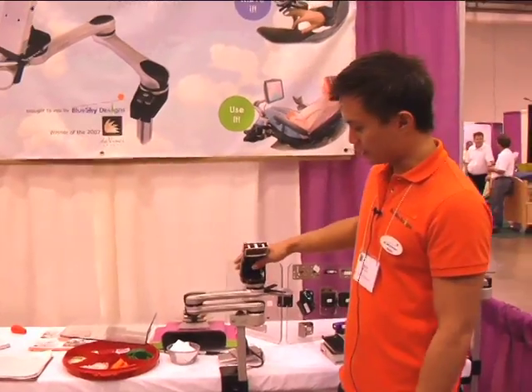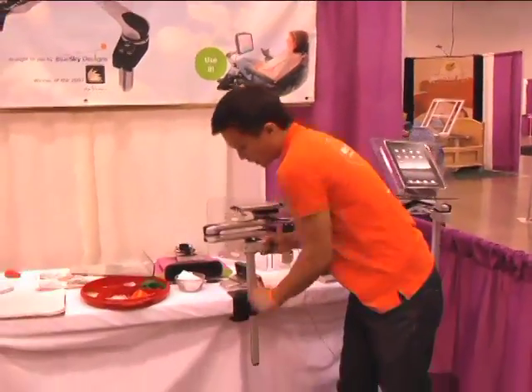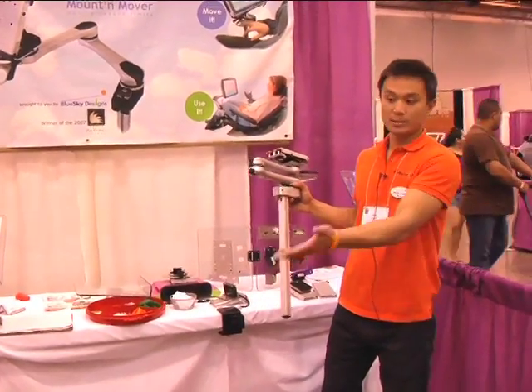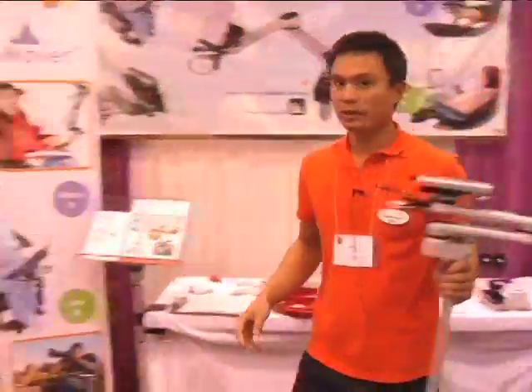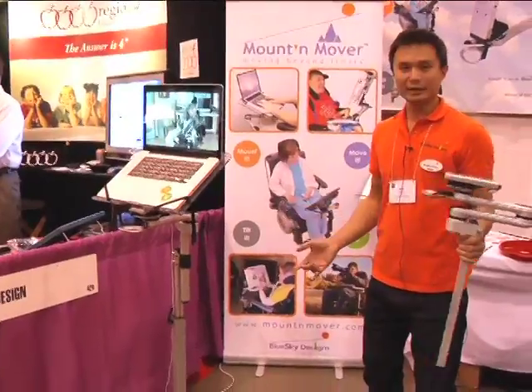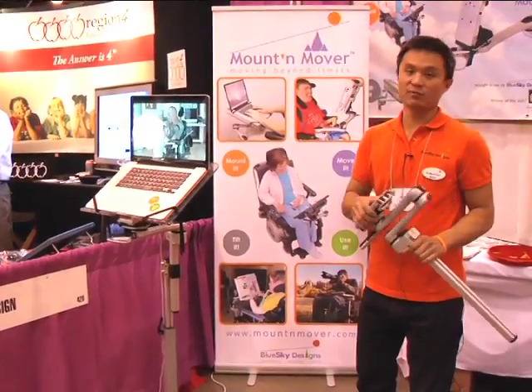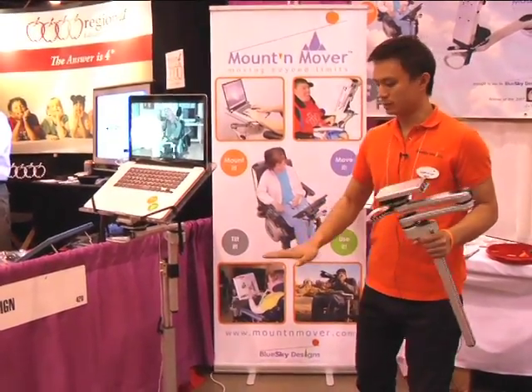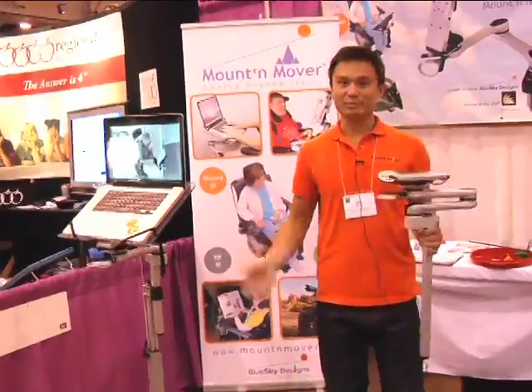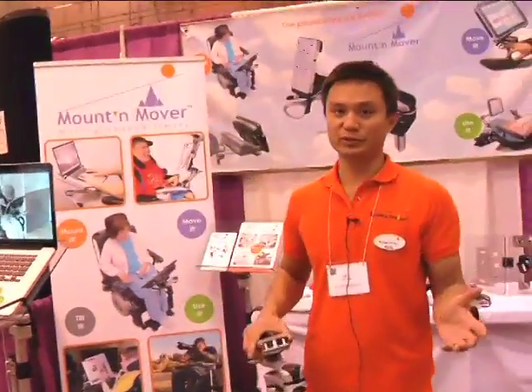When you're done with your mounting system and don't really want to use it anymore, you can take it off your chair and port it to your table, or we have a floor stand over here — which you'd use for either in bed, a recliner, or anything like that. Even if it's a kid who wants to use their device on the floor, the floor stand allows you to use it all the way from six inches up to six feet. If you have any other questions about mounting anything to your wheelchair, give us a call.